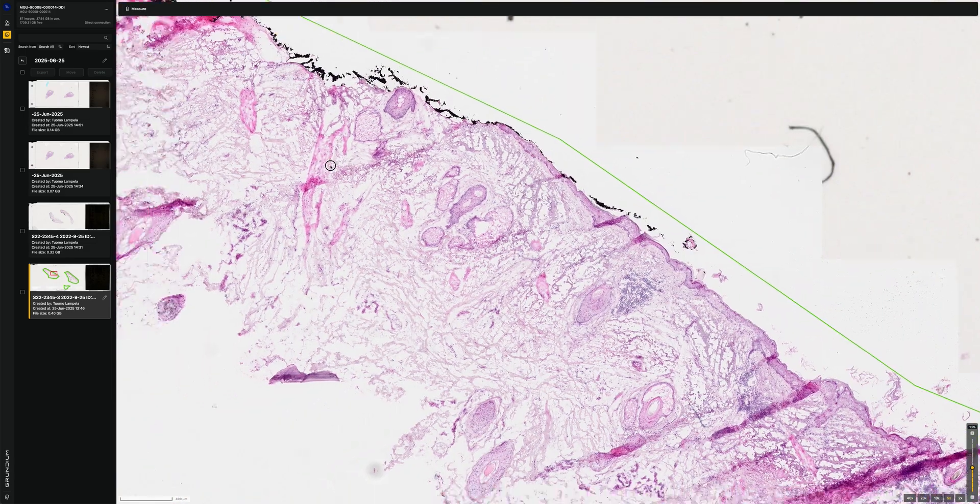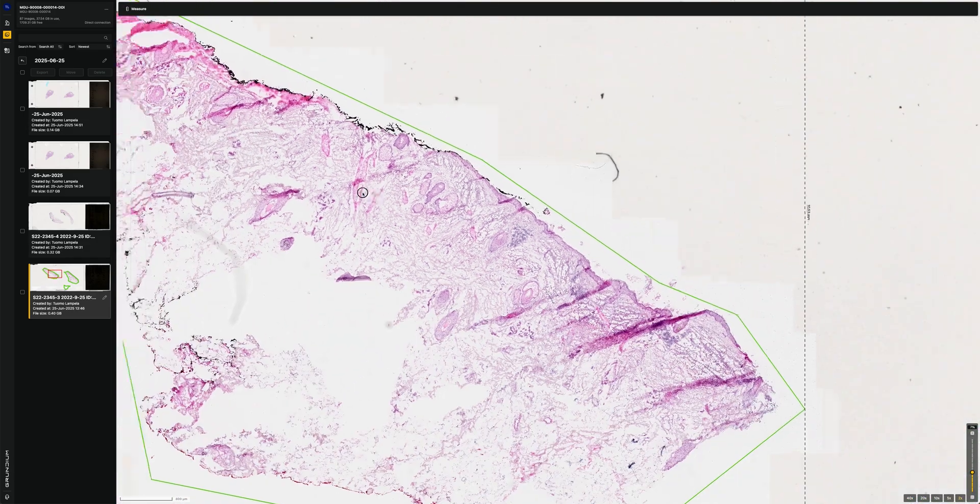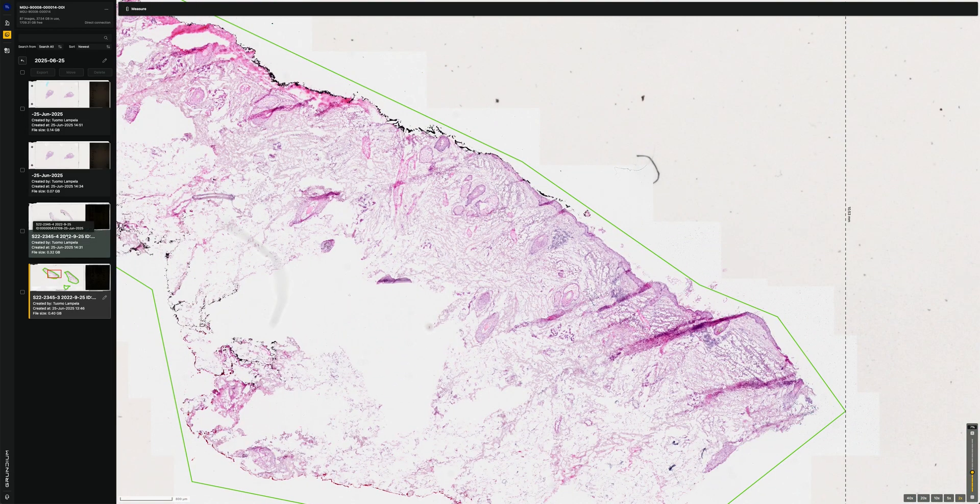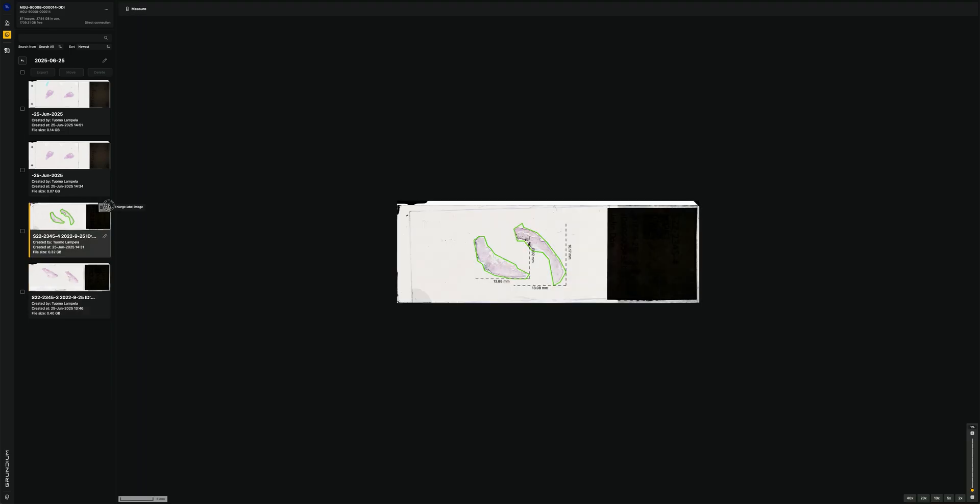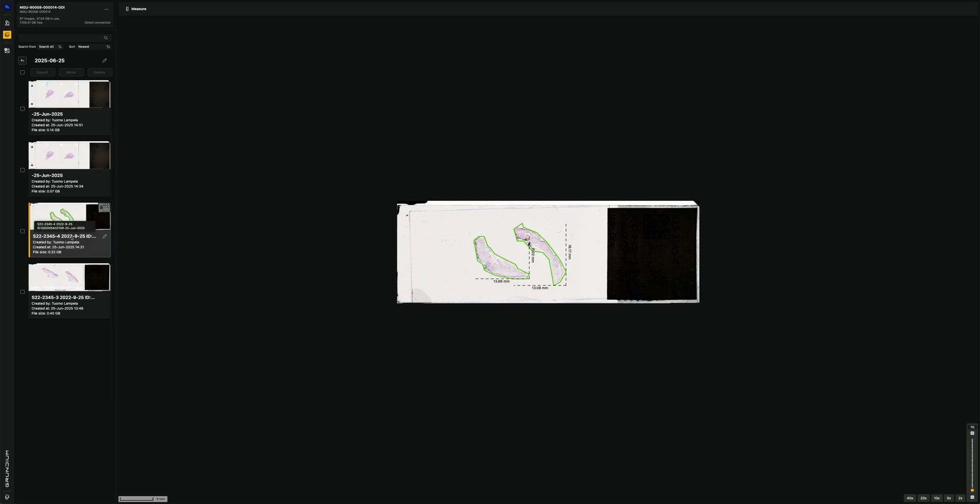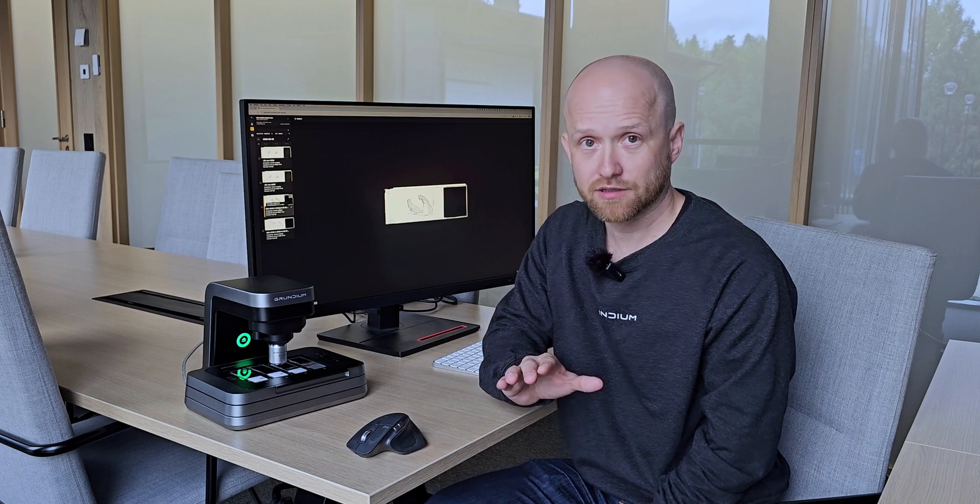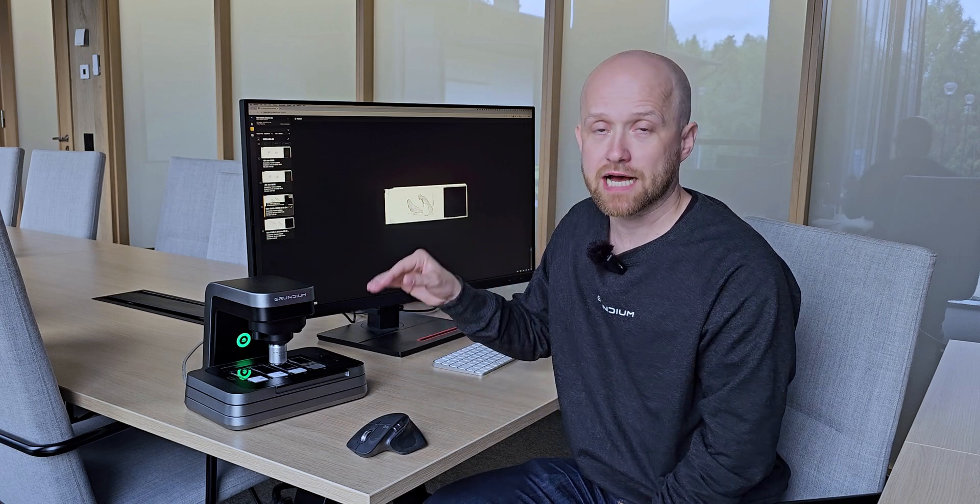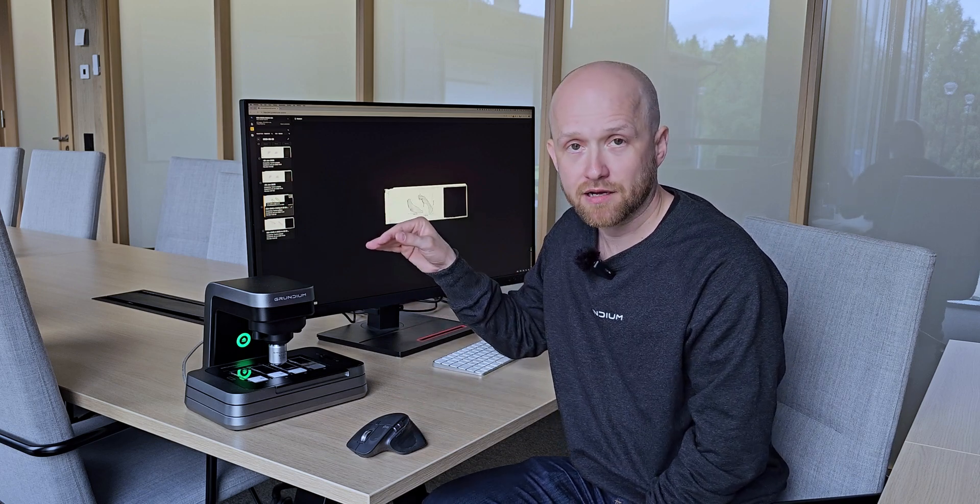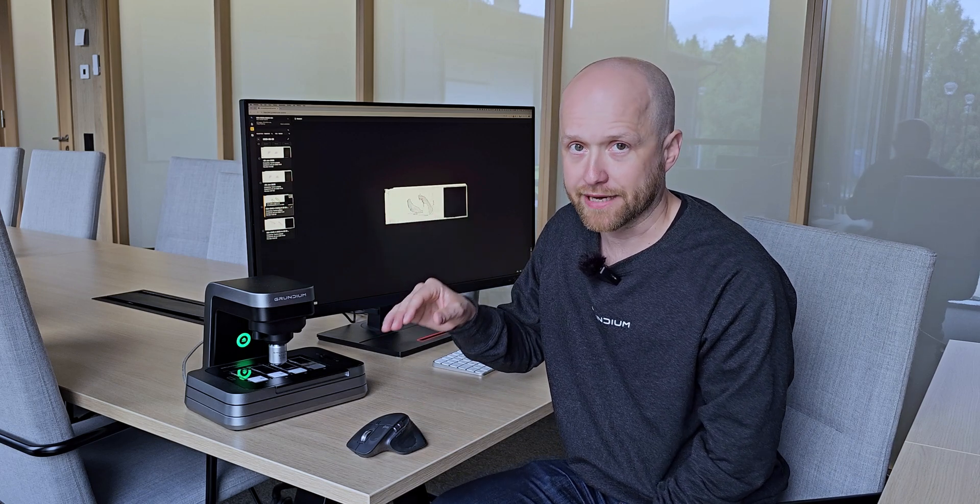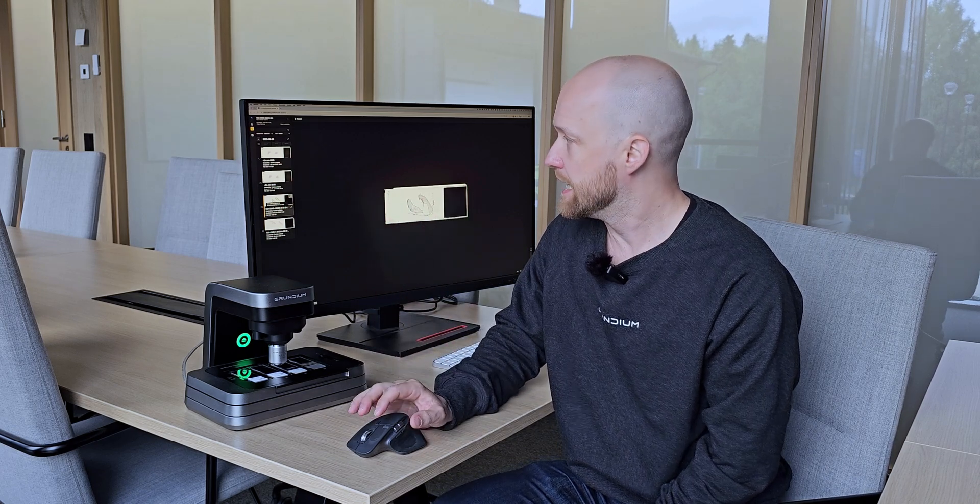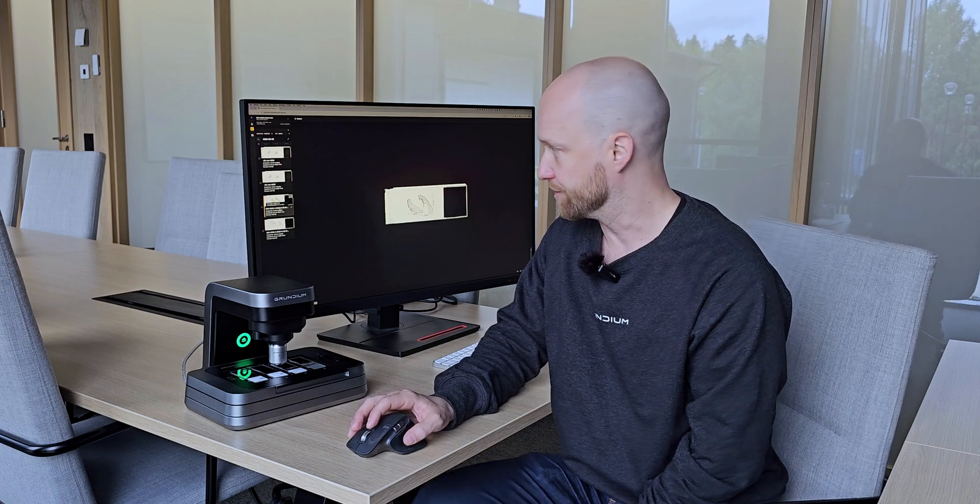And one thing to note is that, for example, in these two cases, we can look at the slide label. And we can see that the image name is actually picked up from the label. So we can automatically read the label and then use that to name the file automatically. That's a good feature.